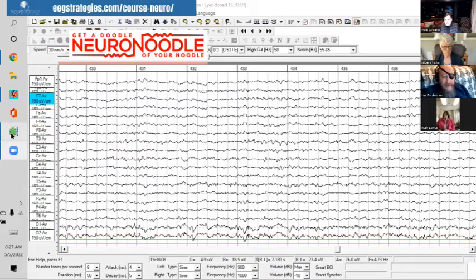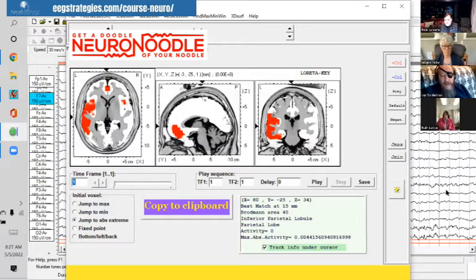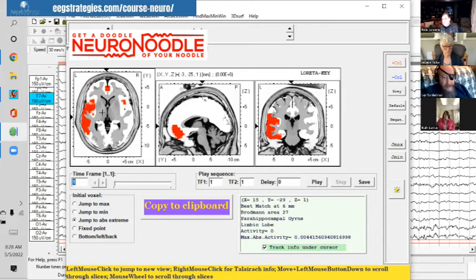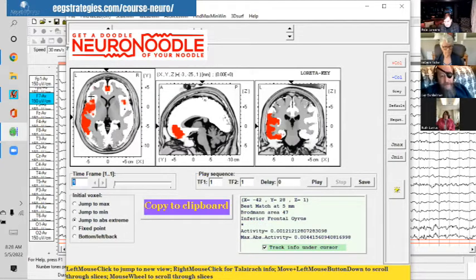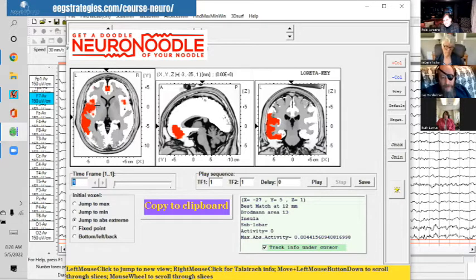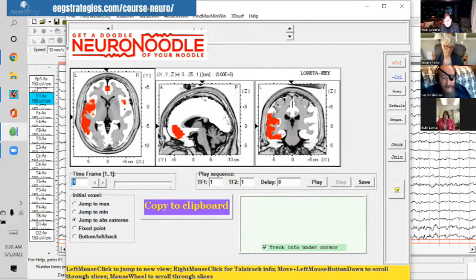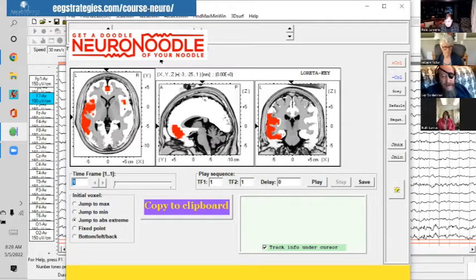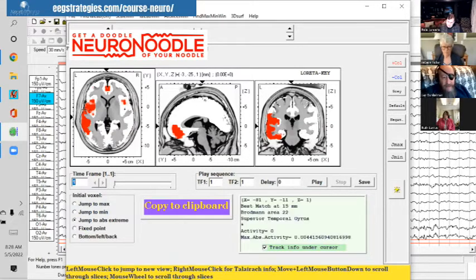There are visualizing tools we can use to do source analysis, and this is the source of that particular feature. It has the insula on the left side, which is undoubtedly involved — the salience network is the anterior cingulate and both insulae. The temporal lobe and insula on the left side are not functioning normally; the frequencies are off. People that have derealization and depersonalization with their PTSD end up having insular involvement like this. If this network isn't working right, things that are actually real and salient don't quite seem right — they don't have the normal salience of something that's real. This is a derealization/depersonalization biomarker.